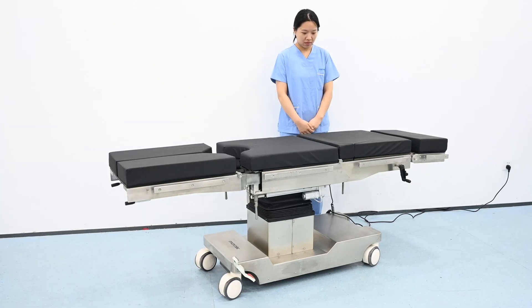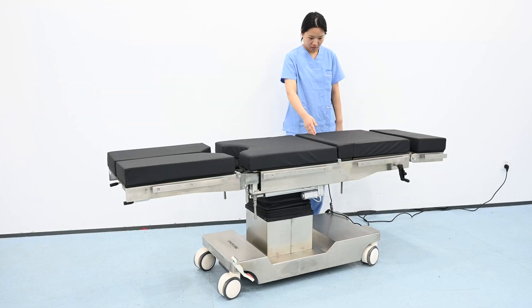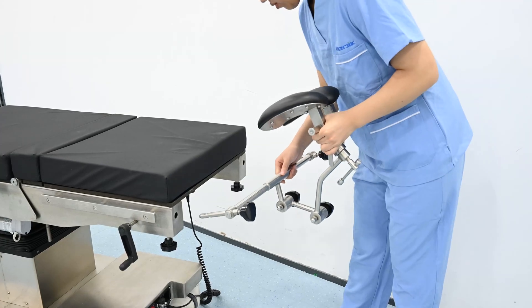First, we are going to adjust the length of the operating table according to the patient's height. We want to line her hip up right here for the kidney flex. We add a headrest.